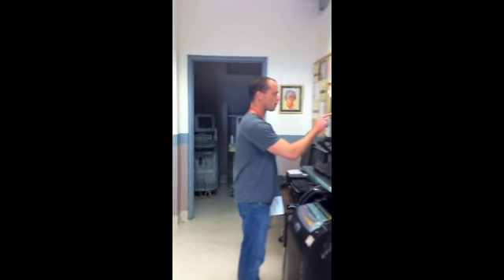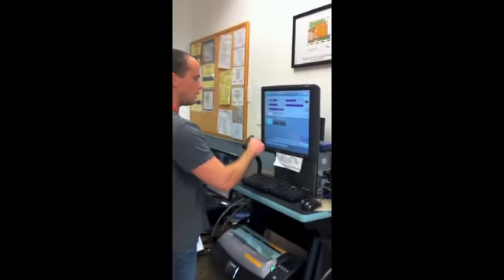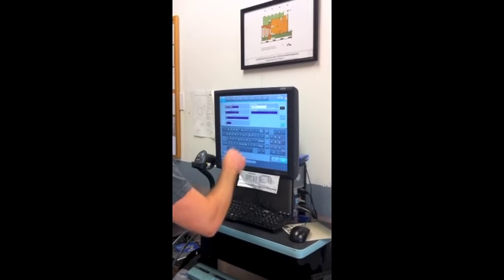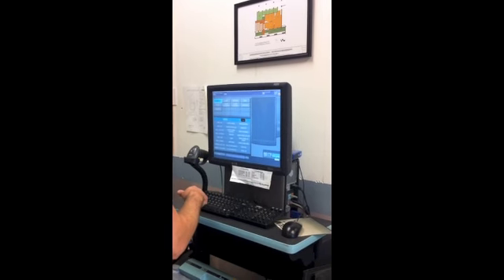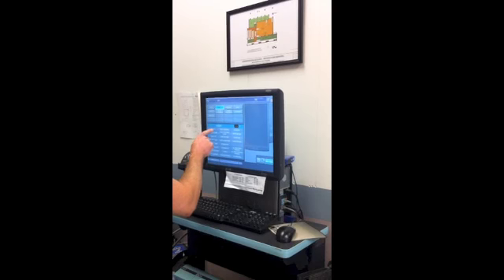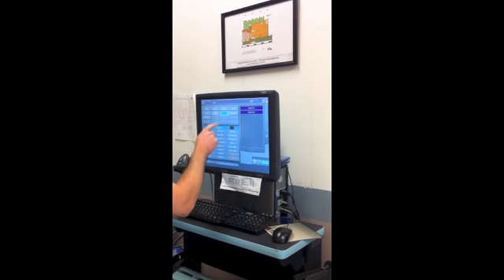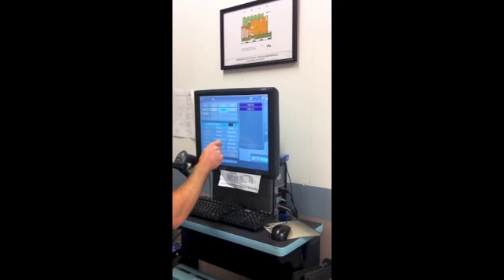We will be doing chest, PA and lateral, and we'll also be doing knee, AP, medial oblique, lateral, sunrise, and tunnel. So first, before I get the patient, before anything else, as soon as I get the rec, I set up on the computer. Patient's name, patient's gender, patient's date of birth, and start.